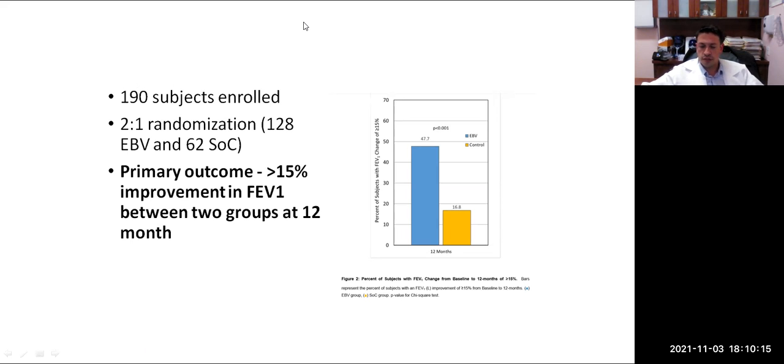There are some clinical trials in Germany that will be studying how to get around the collateral ventilation issue, but we really don't have an option for those patients right now. But once you select them on the PFT criteria, that is probably the biggest exclusion criteria that I see.